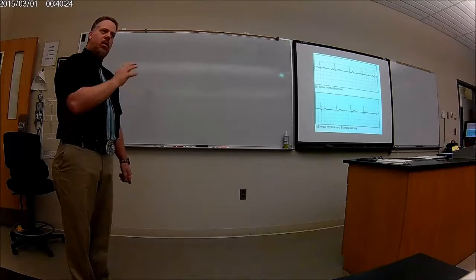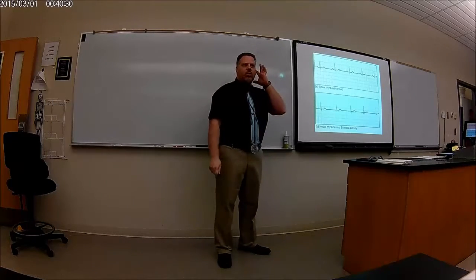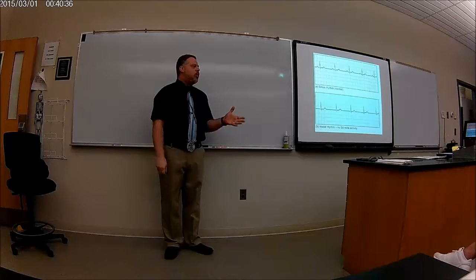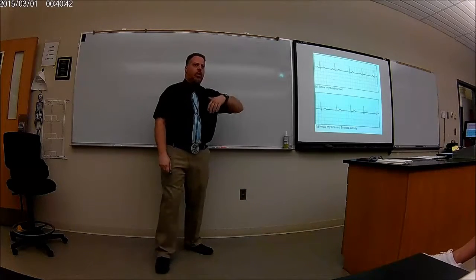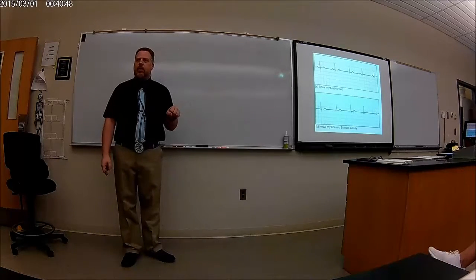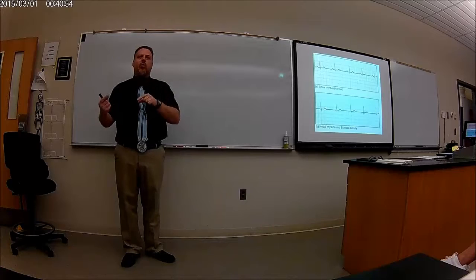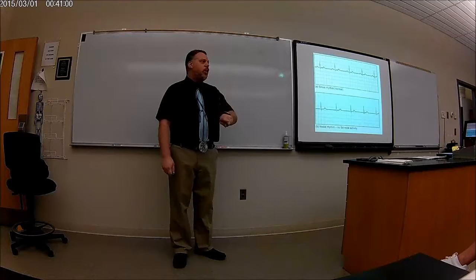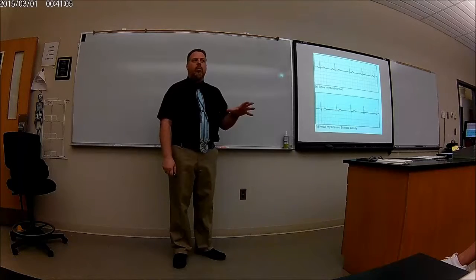I'm not going to get it heavy, but you could have some idea. If you understand what each part is and what each part represents, then you can tell if that part is removed. This is how I teach. If you haven't caught on to my style, it's not just memorizing things. A P wave, what does that do? Oh, it's going to be atrial depolarization. Yeah, but what does that mean? What happens if we take it away? And what can be possibly wrong? I'm doing the same thing as all other teachers, but I'm doing it in a different way. I want you to know how to use this stuff, because this is what you're going to be asked in your future. So you might as well get your brain wired thinking about this if we remove it, okay?